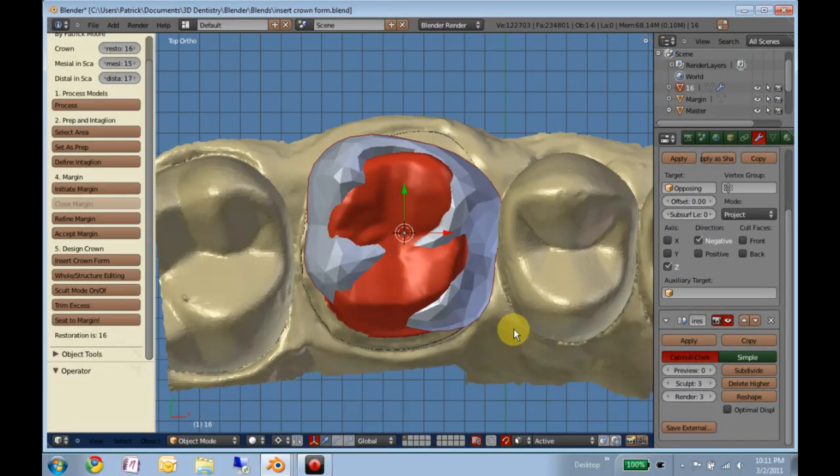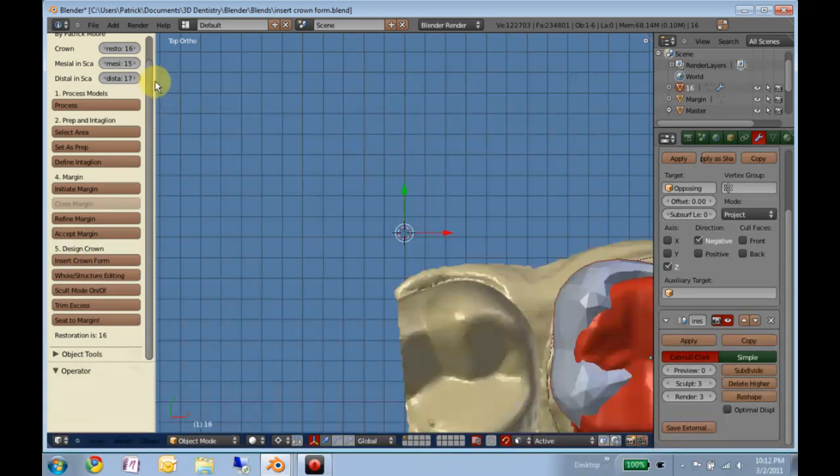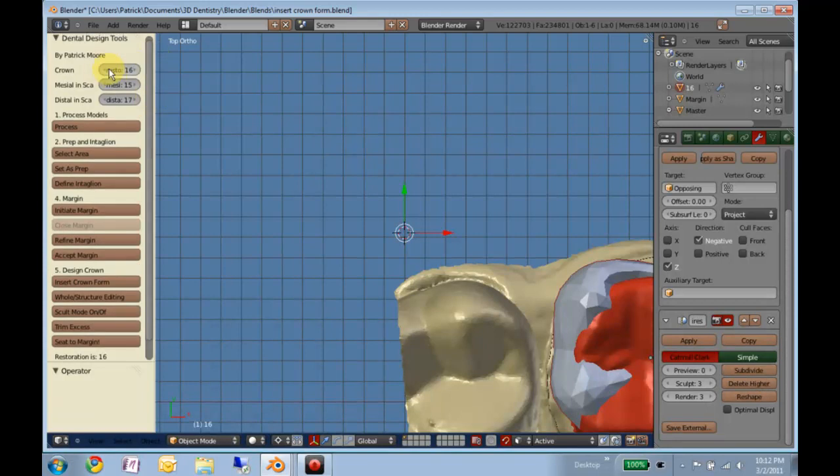Okay, now that our margin is defined, the next thing we need is a crown. I forgot to start screen recording before I got started, but all I did was click Insert Crown Form right here. And what that does is put this template of whatever you have set as the restoration up here.